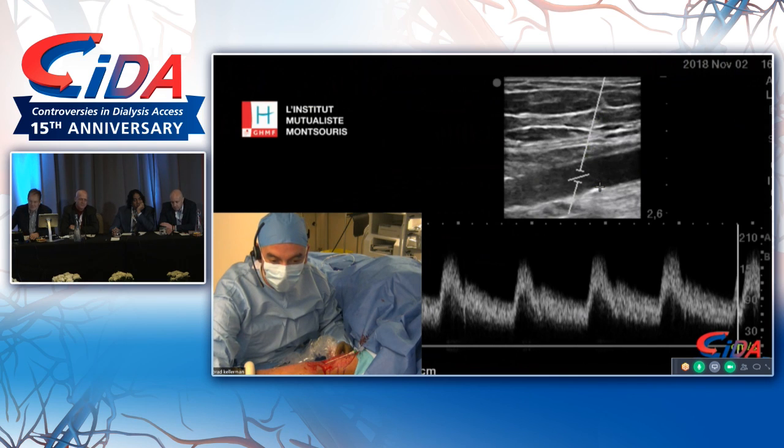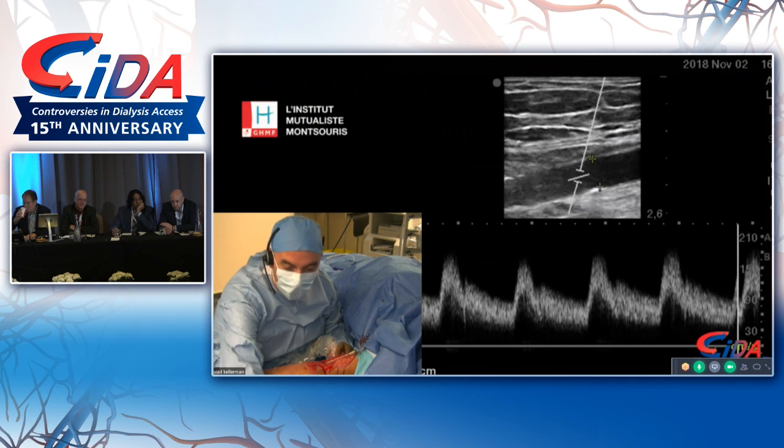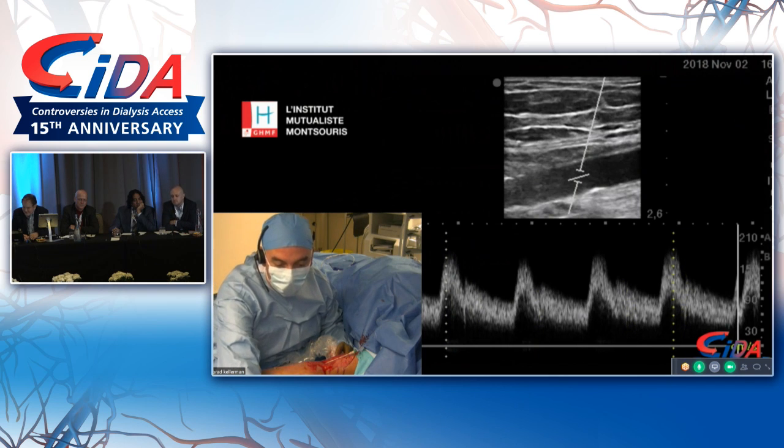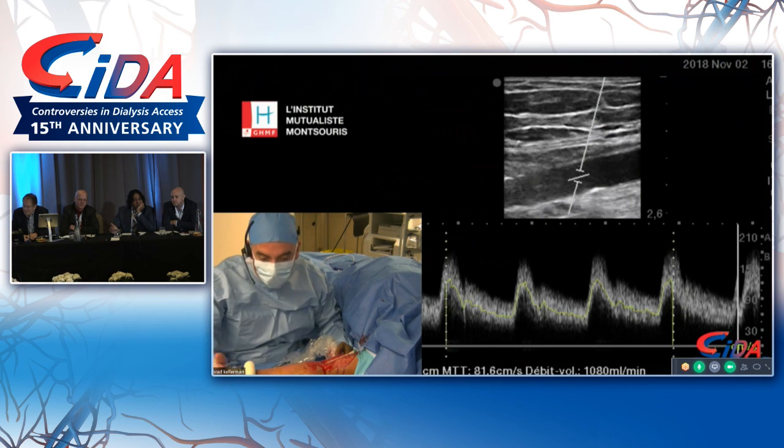And do you need to keep the patient in hospital overnight, or will they go home later this afternoon? No, it's definitely day surgery. And to be honest, I think in a few years, we'll be able to do this in clinics. You see all these things here, we do it in surgery, but I think it's an overkill for sure. The procedure is so simple. If you see, actually, I have a liter of flow here. It's unbelievable. I have a liter of flow.